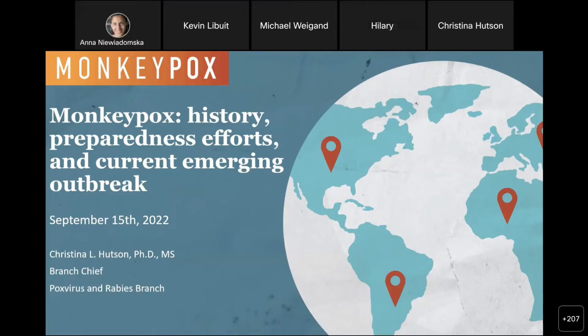And so everyone is very familiar with the current monkeypox outbreak. This is just the current global numbers, which can be found on our CDC webpage for anyone who is interested. So for testing, we started out in our LRN labs, again, which already had the FDA cleared test because of the smallpox research agenda. And so at the start of the outbreak, those labs had the capacity to test around 10,000 per week. This is a non-variola orthopox test, so it doesn't specifically test for monkeypox.